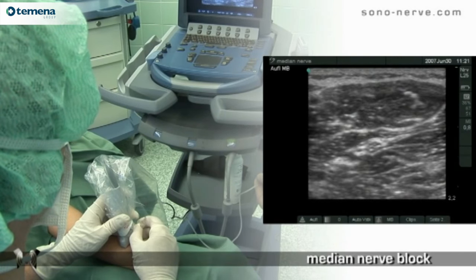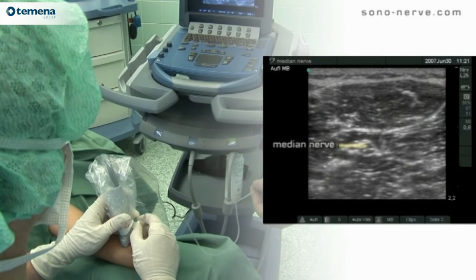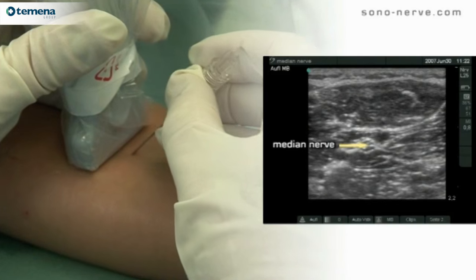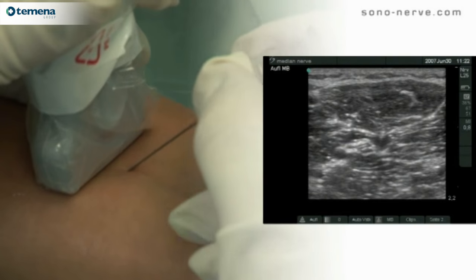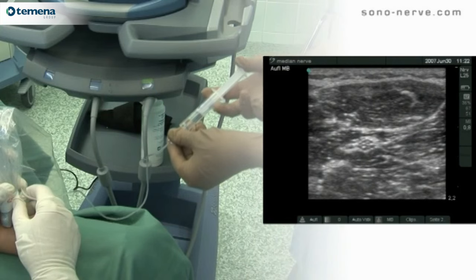The needle is passed through the belly of the flexor digitorum superficialis muscle towards the nerve. Once the needle is in close proximity to the nerve, local anaesthetic is injected.